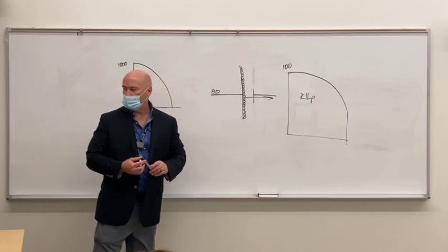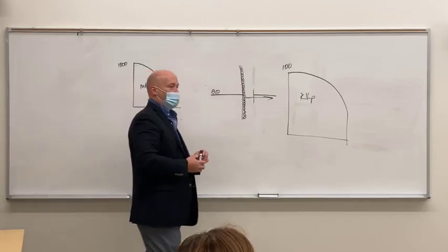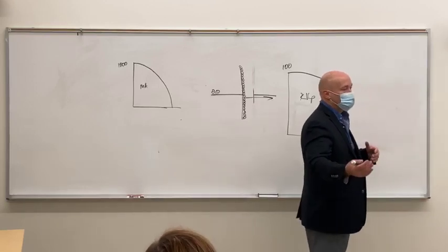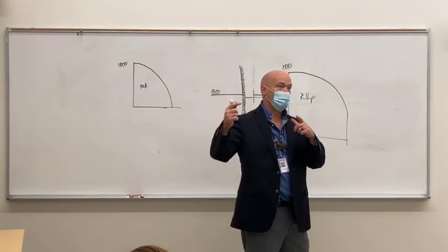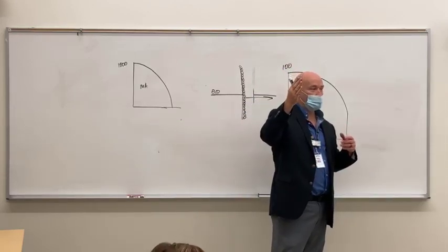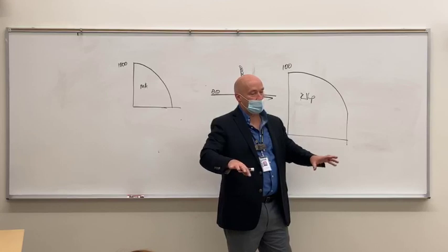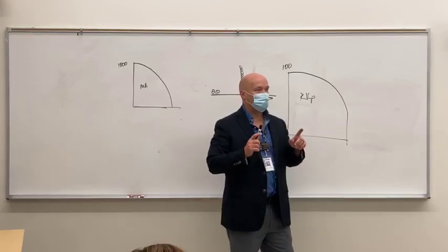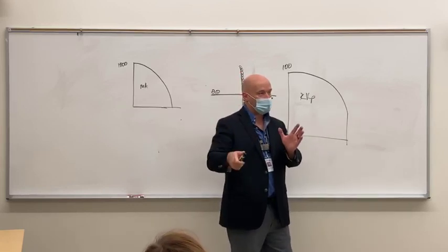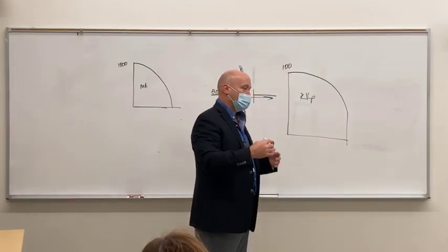All right, any other questions? I think we talked about all the other components, didn't we? Can you repeat that one more time? Which part? About where it's wired in and why? Yeah, it's wired into the high voltage circuit because we actually have to count the number of electrons that truly travel across the tube. We set our amperage in the low voltage circuit, in the filament circuit. But what we need to know is how many actually made the jump across the tube. So we have to have it in the high voltage circuit so we count them as they return into the system. That's why it's wired into the high voltage system.